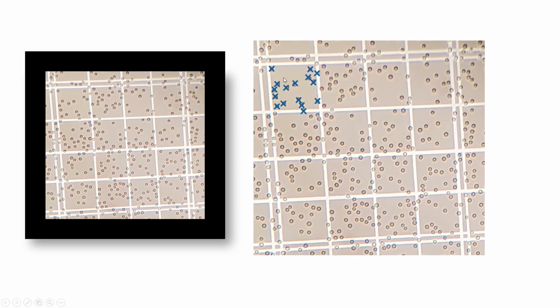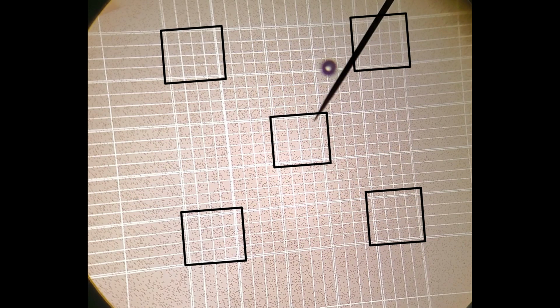Then I'm going to mark how many red blood cells I counted just in this little box, and then I would move over to the next box and do the same thing, and the next box, and the next box. Then you add up all of these numbers, and that gives you the total for a single box. Then you have to do that 4 more times in order to get the total red blood cell count for that sample.